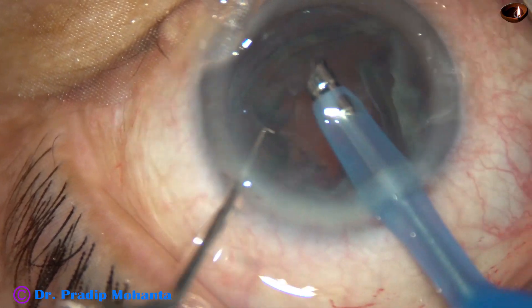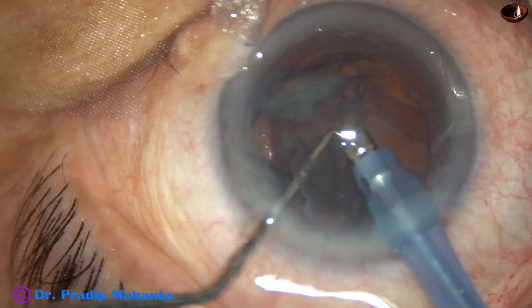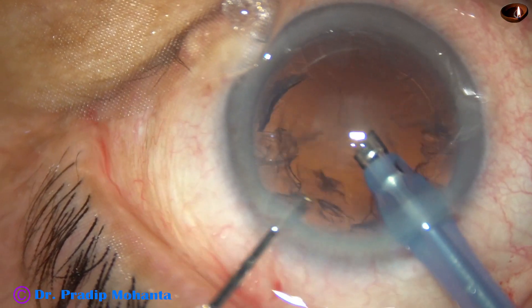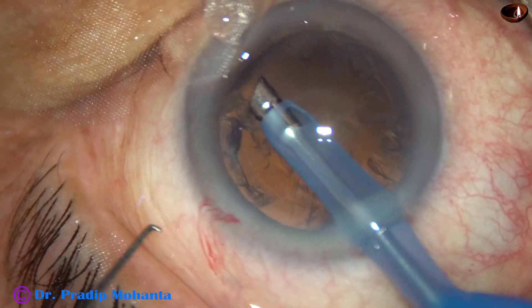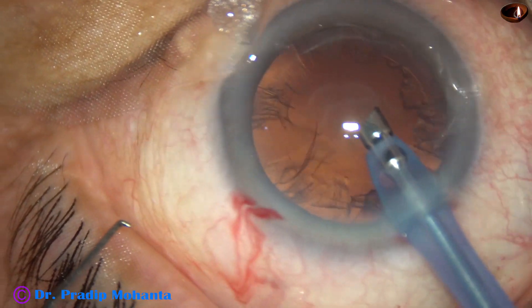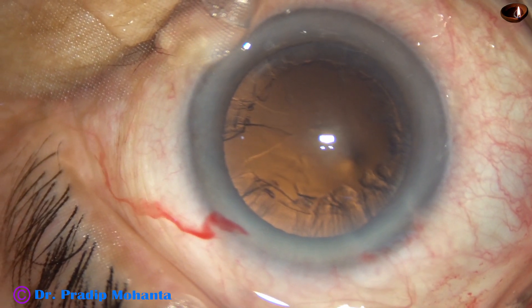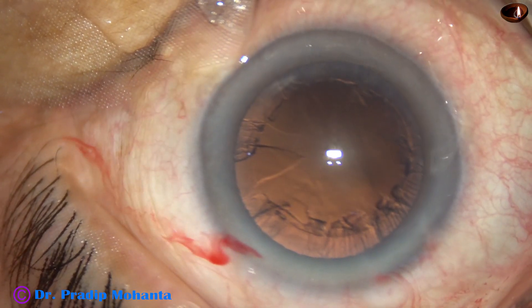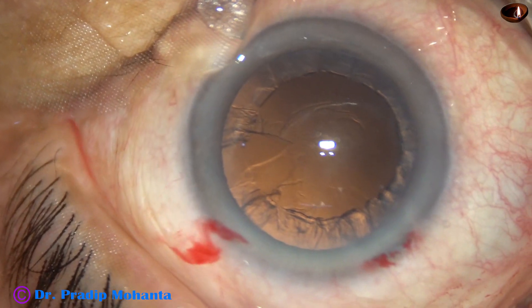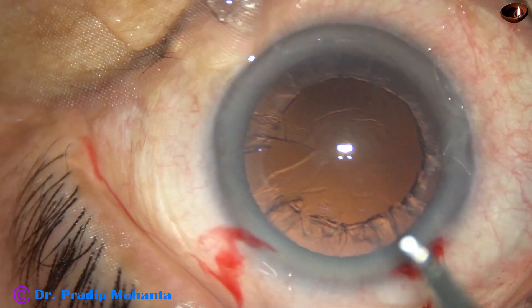The nucleus is managed, and now the epinucleus flips and comes off. Cortical aspiration is being done. I removed a part of the cortex by the phaco handpiece itself. Now I am going to use the coaxial irrigation-aspiration.